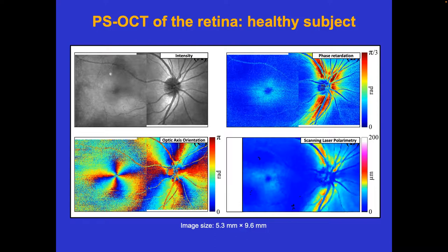Okay, what do you measure? You can measure the thickness, but it doesn't change. It's the density of the axons that is really important. And we think this is a means of measuring the density of these axons, why it could be an earlier indicator of nerve damage than just thickness measurements.